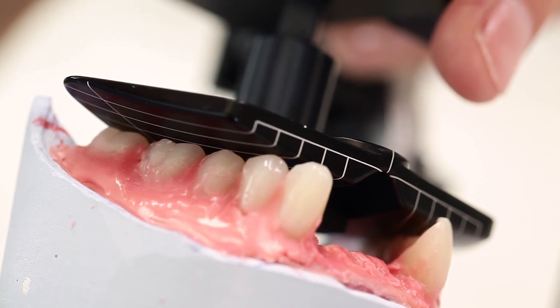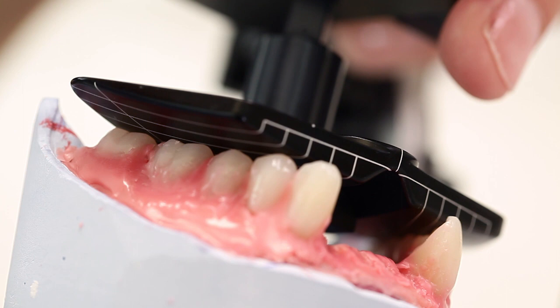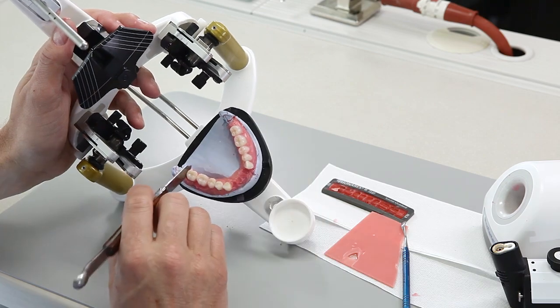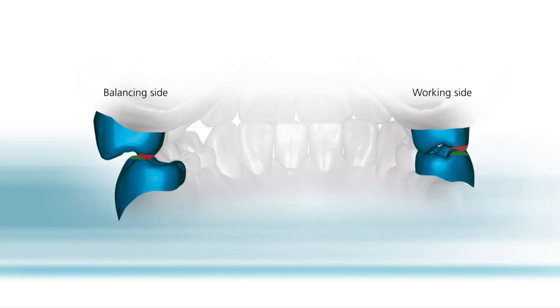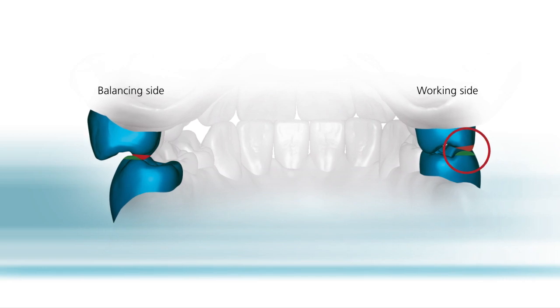The line system of the template facilitates the symmetrical setup of the posterior teeth. Nevertheless, there is a certain range of variation. The type teeth from Ivoclar Vivadent implement the concept by Dr. Strack. It's based on the simultaneous group contact both on the working and balancing sides.